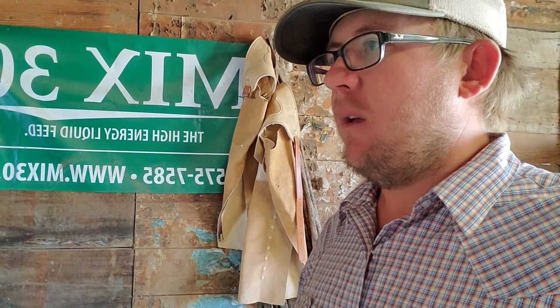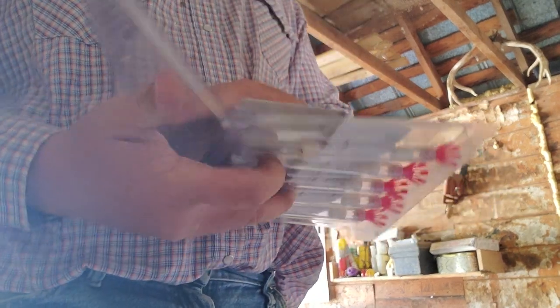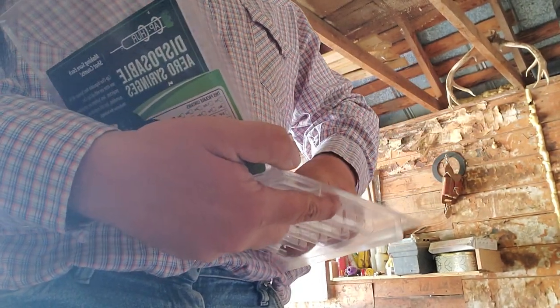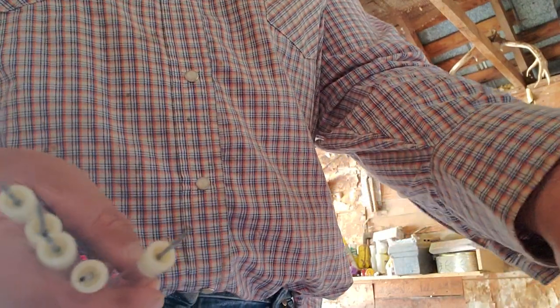The thing about these darts is you have to run a drug where the viscosity can't be very high in the material. If you run a drug through it that's got a very high viscosity — something that's really thick like a Resflor or a drug like that — it will not work very well.